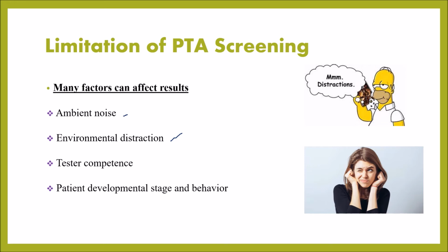The third factor, tester competence. The experience and techniques of the tester will greatly affect the screening result. And finally, patient developmental stage and behavior. Patients need to be cognitively and physically mature enough in order to understand the instruction and give cooperation to the tester.